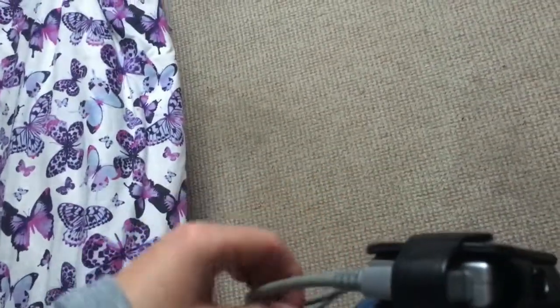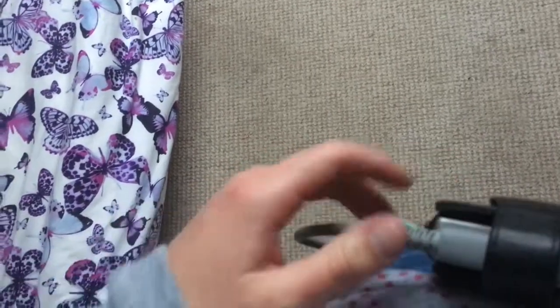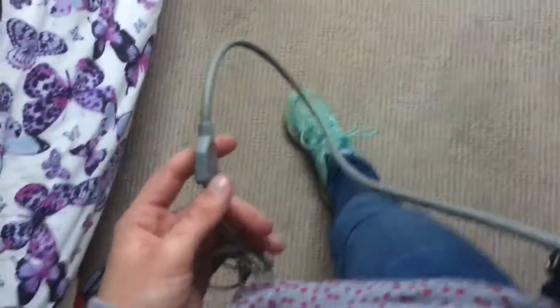It's a very old version. Pretty sure I had a newer version last time that had like a string and it dangled around my neck. Do you think I was vlogging then? I'll go back and see.